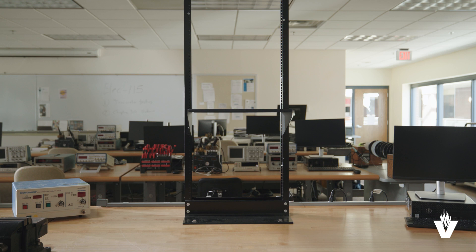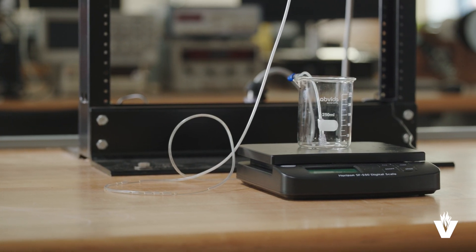We'll need a rack or stand with a shelf, platform scales, and beakers.